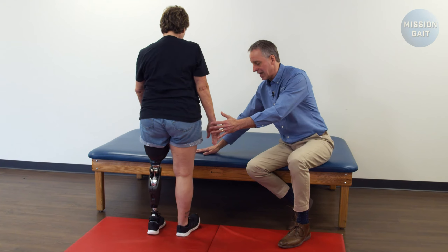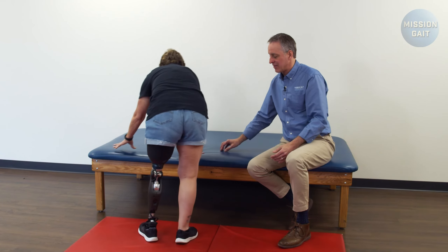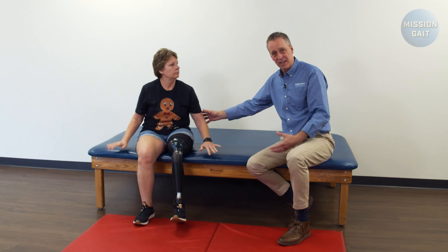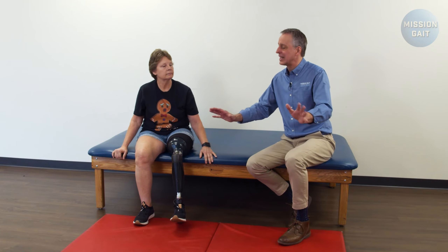Once she's up, always tell the patient to go ahead and turn and have a seat if you have a place to sit, because obviously sometimes when you first get up, your heart's still beating a little bit from the fall and you just need to collect your thoughts before you take off.